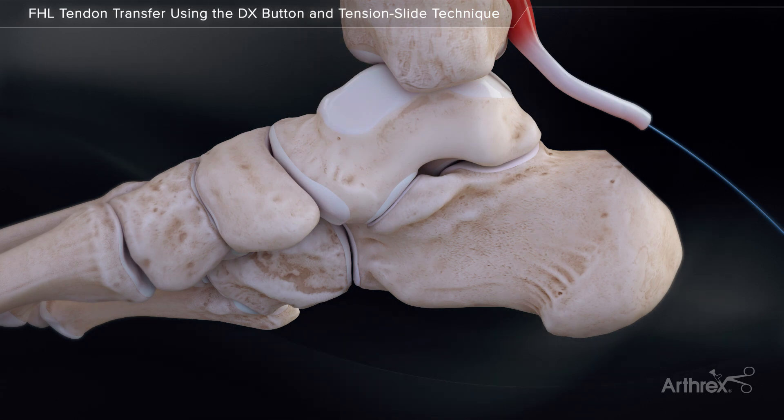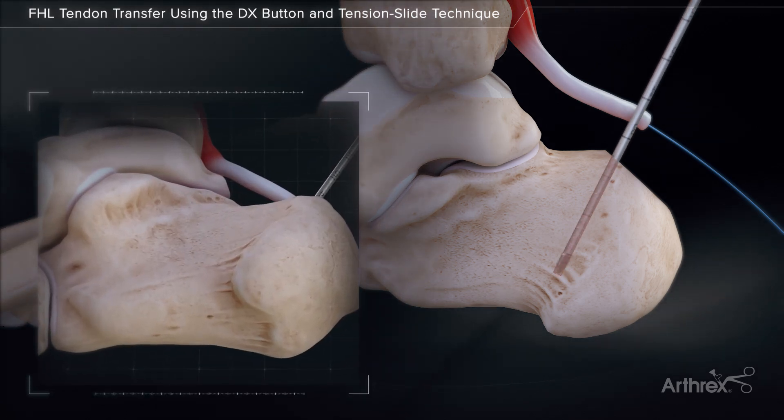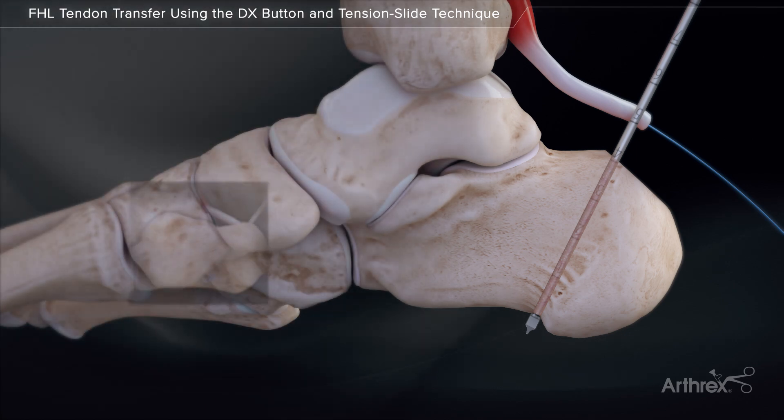On the superior calcaneus, approximately 1 cm anterior to the Achilles insertion, drill the 3.2 mm spade tip drill pin by cortical aiming 1 cm anterior to exit the plantar surface in the midline of the calcaneus, centered medial to lateral. Fluoroscopy is recommended to ensure the 3.2 mm spade tip pin just breaches the plantar cortex. It is important to make sure the drill does not exit along the plantar posterior tuberosity.